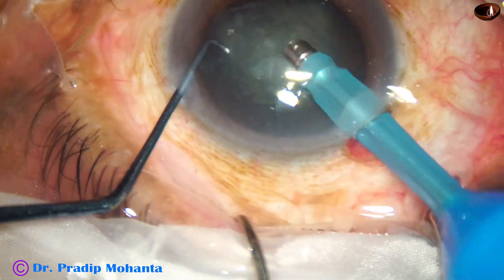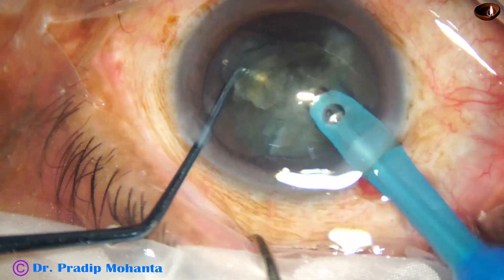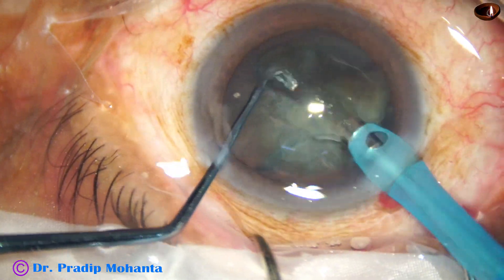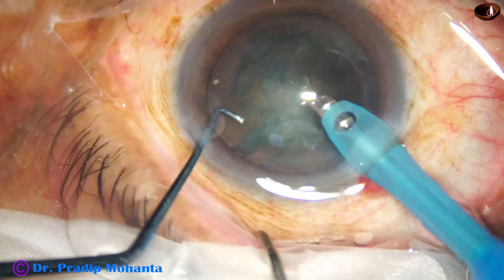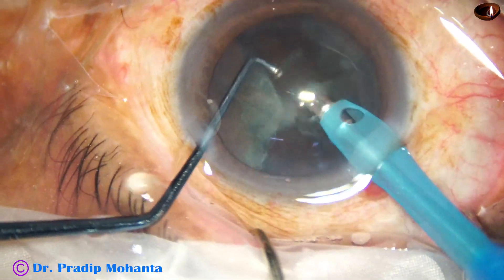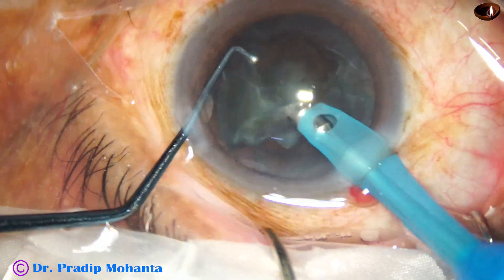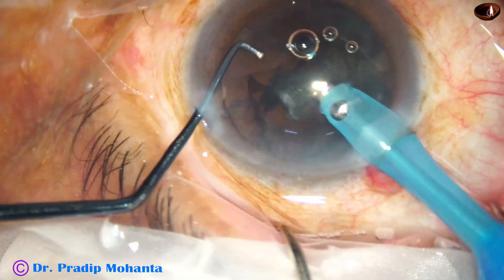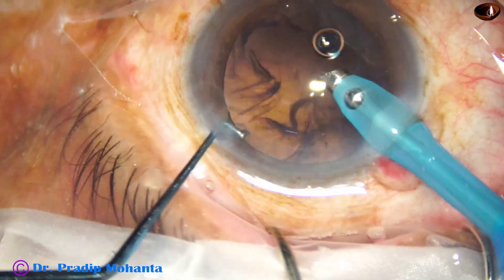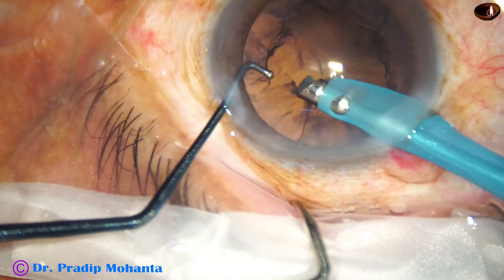We just have to emulsify the pieces. This is one piece, this is the second piece. Ultrasonic energy is set at 60%, flow rate is 45 ml per minute, vacuum is 450 mmHg. This is the last nuclear fragment. Now the epinuclear shell is removed, and now see the removal of cortex by the phaco needle itself.